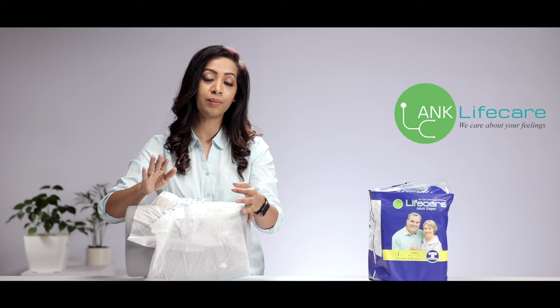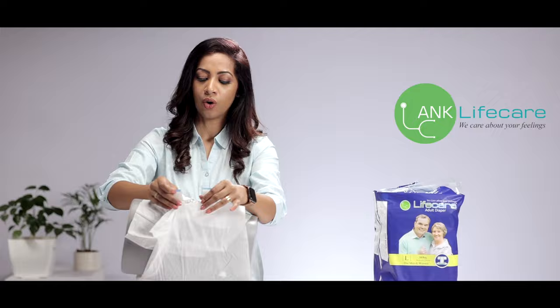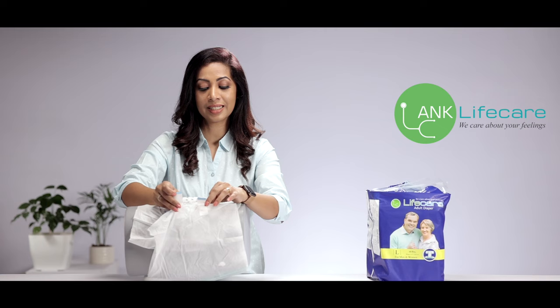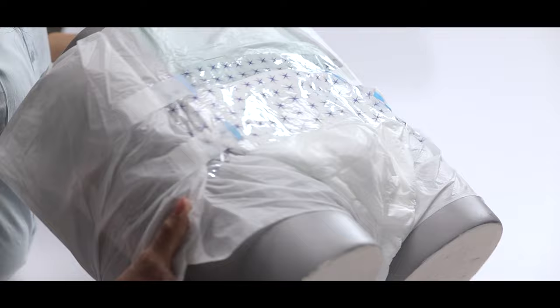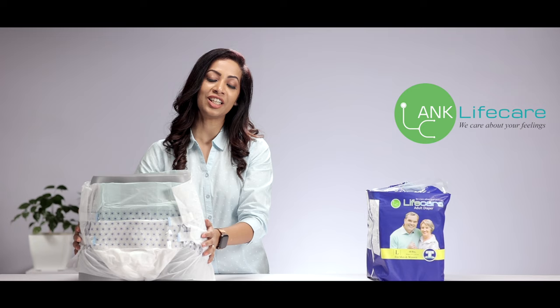The refastenable side tapes have an amazing advantage: the caregiver can just open the side tapes to check if the diaper is soiled or needs to be changed. Also, if it is not tight enough and needs to be tightened or repositioned, it can be reopened and readjusted. Discarding is also quite easy — just remove the readjustable side tapes and discard it just like any other sanitary product.